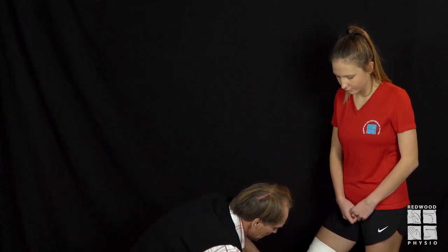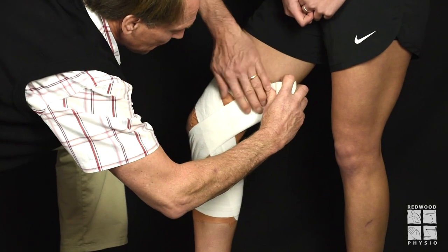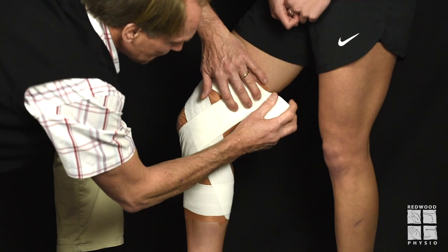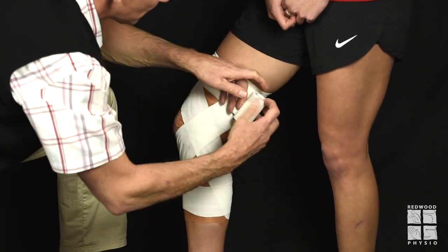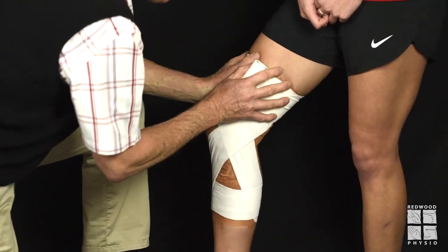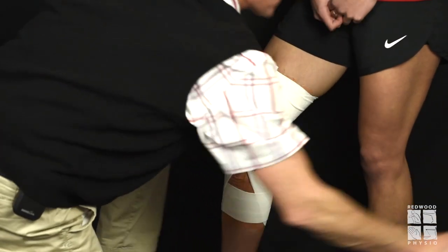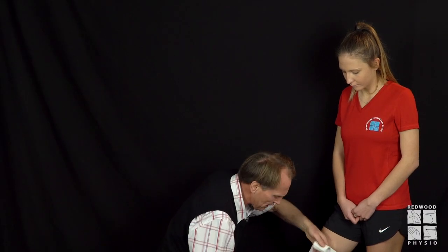Then up over the medial ligament. The beauty of this EAB is it can almost turn at 90 degrees. We come around, catch that around there again, and finish.